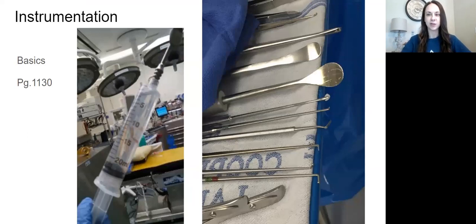So I put this picture down for your basics for a reason. So you need to know all your basics in your book for spine and crani. But on this Mayo stand here, you'll see a few instruments that are both. Like, this looks like a spine setup to me, definitely. But a lot of the instruments are used for both spine and cranial neurosurgery.